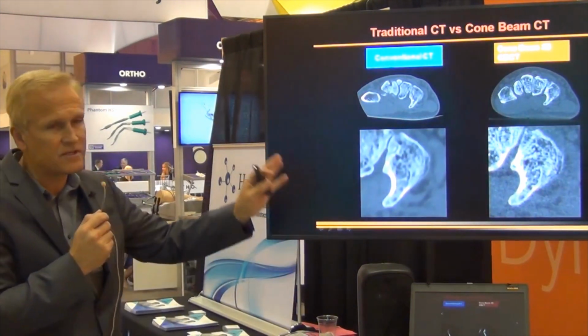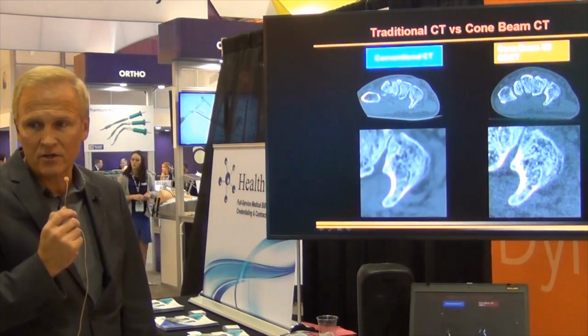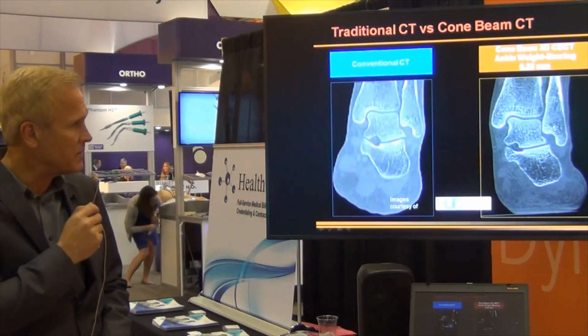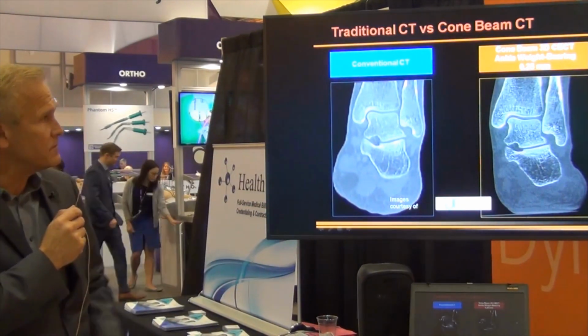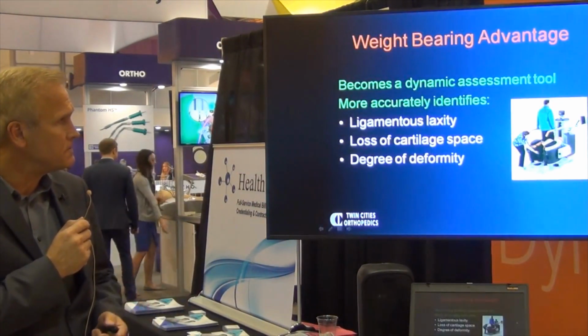And that's pretty consistent with what I'm seeing in the lower extremity too. The resolution is very impressive, much better than the traditional CT scans that I've been getting. Again, it's another coronal view through the ankle and subtalar joints, the hindfoot.